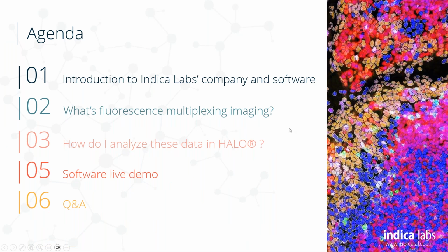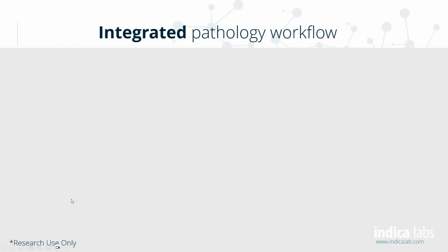So let's start with today's agenda. I will first introduce our software ecosystem, and we'll then cover the fundamentals of fluorescence multiplexing imaging and explore the key technologies available. I'll also guide you through how to intuitively analyze multiplex fluorescence data using the HALO software. And this session will include a live demonstration and a Q&A at the end.